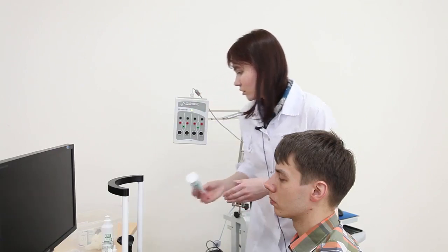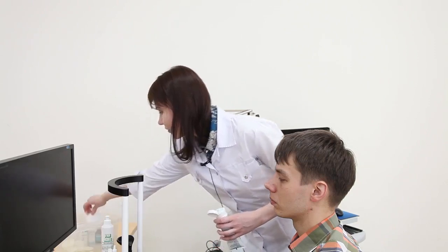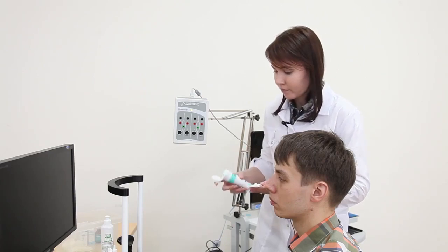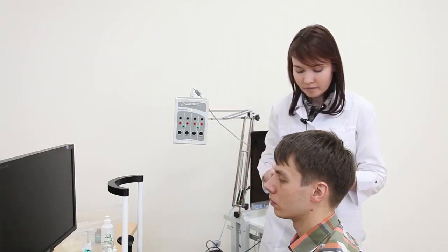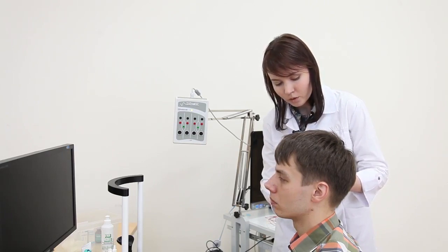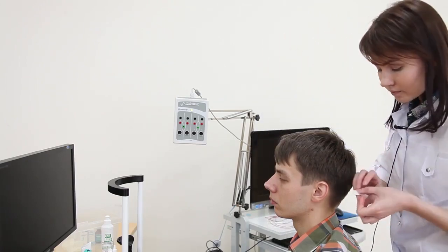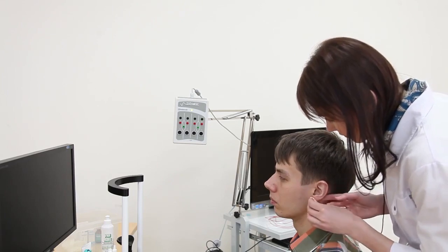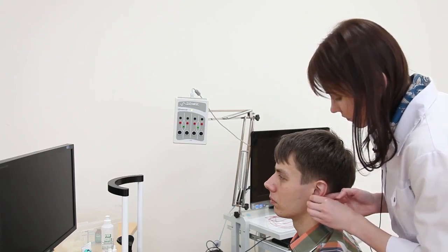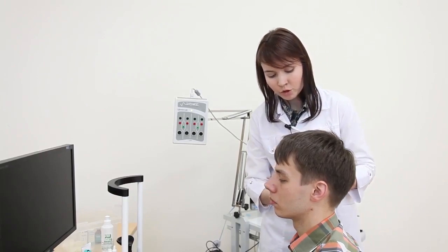and then the abrasive paste. That is rubbed up to slight skin reddening. The remains of the abrasive paste can be removed.